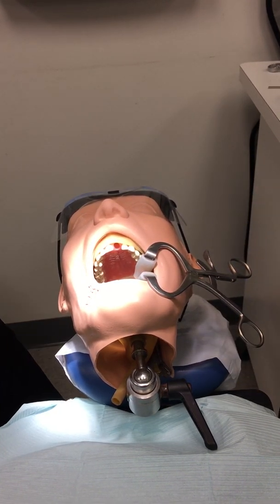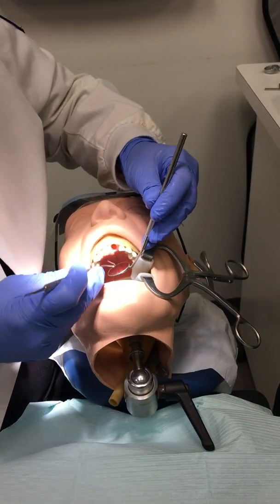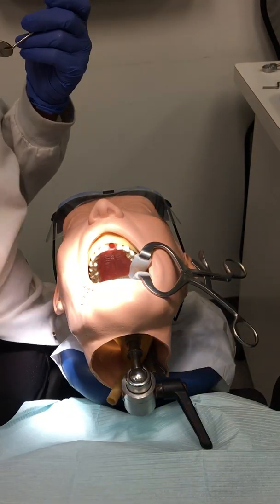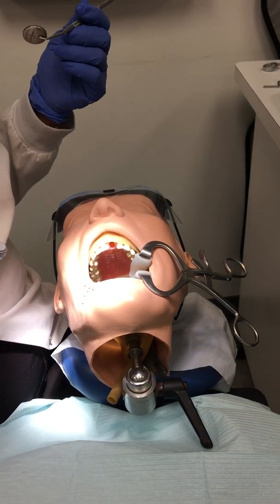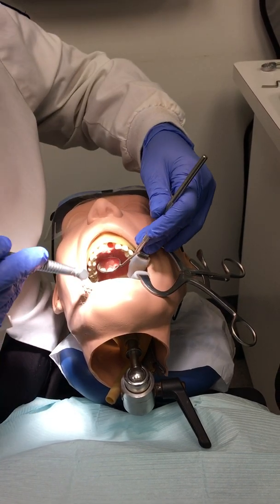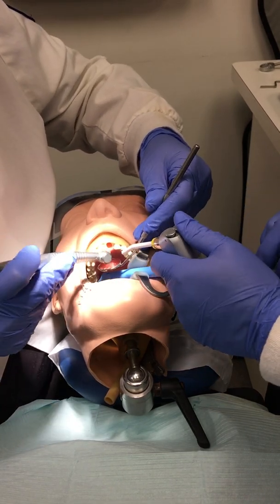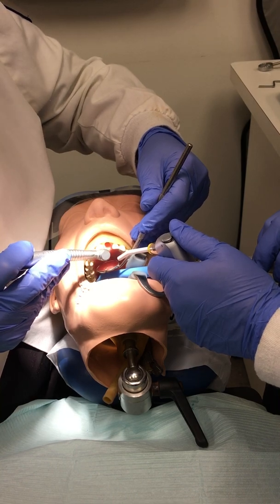When the doctor is ready, transfer the mirror and explorer to the doctor. The doctor will check to see if the patient is numb, then retrieve the explorer. Grab the HVE and air-water syringe. The doctor will prep the tooth using high-speed and/or slow-speed handpieces.